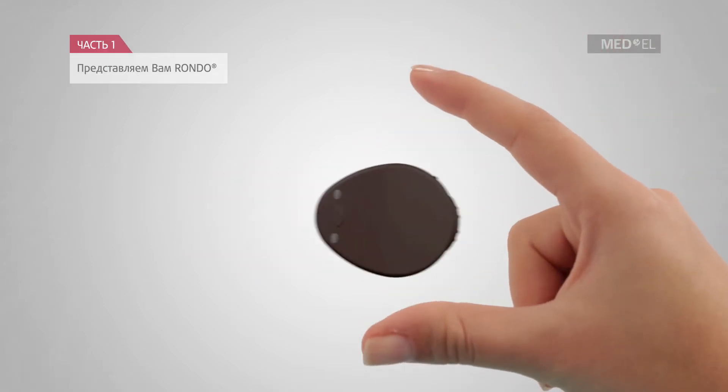This is the RONDO Single Unit Processor. It is the world's first cable-free single unit processor for cochlear implants. The coil, control unit, and battery pack are integrated into one device.